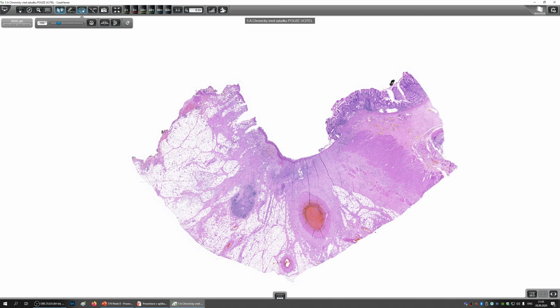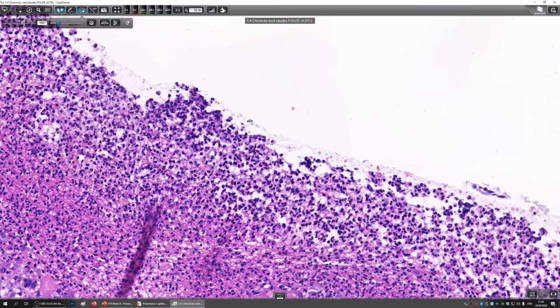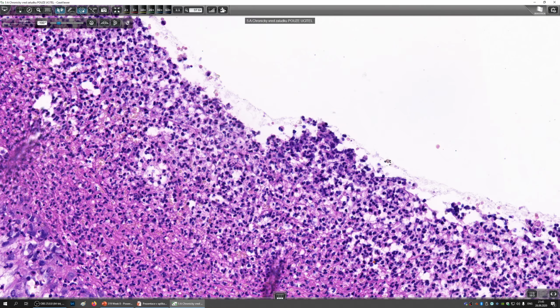I think this one ended badly for the patient. Unfortunately, the patient got a shock with multi-organ failure and didn't make it. So this is a textbook example of a big chronic ulcer which can kill the patient. So now let's check out the ulcer a bit closer. On the bottom of the ulcer you can see exudate. Here you see a lot of neutrophils and macrophages and fibrin. Here's the fibrin. See the fibrin mesh with the neutrophils and different inflammatory cells.